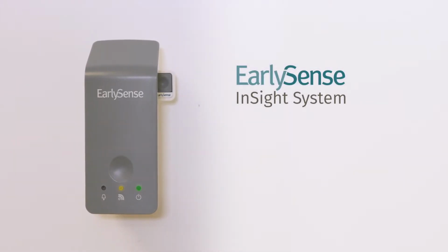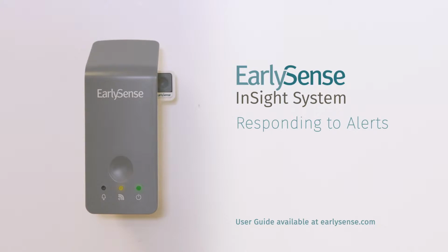The EarlySense system can be used in different modules according to a patient's medical needs. This video will demonstrate how to respond to an active alert at the bedside and CDS, as well as how to suspend the system. For additional information on how to operate the EarlySense system, please refer to the relevant user guide provided upon installation or online at earlysense.com.